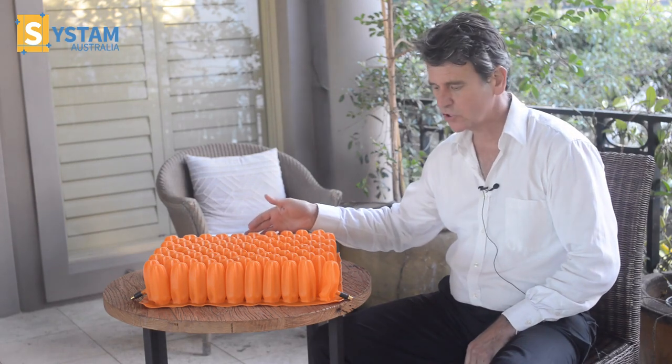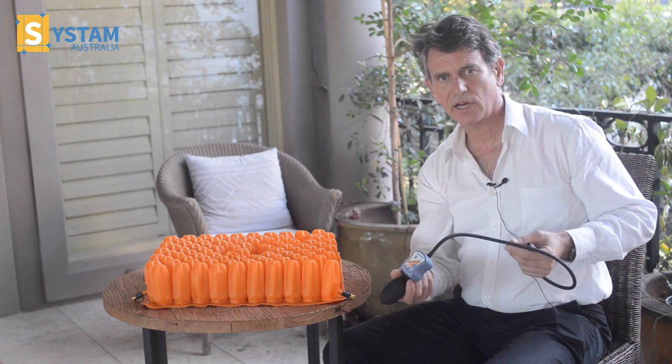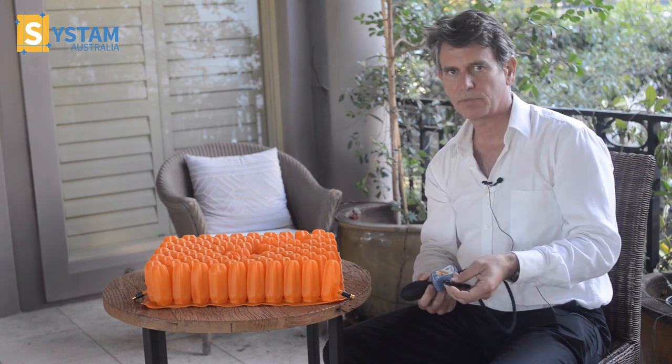This is the inside of the poly air cushion. I'm now going to show you what's happening underneath the cover when we inflate the poly air cushion.